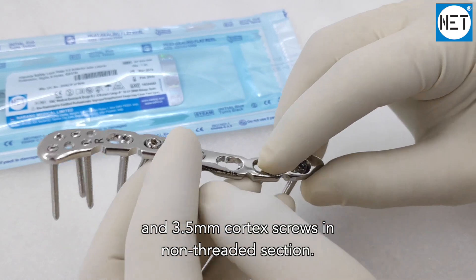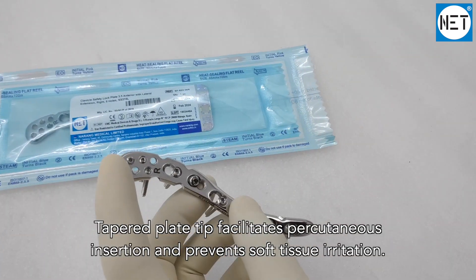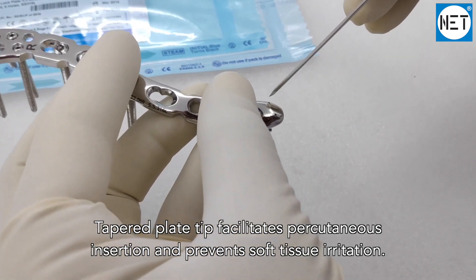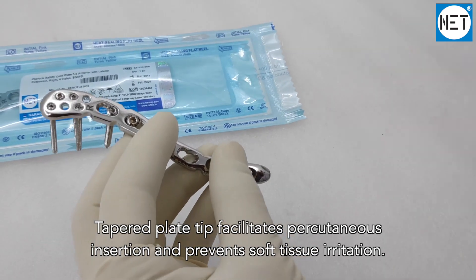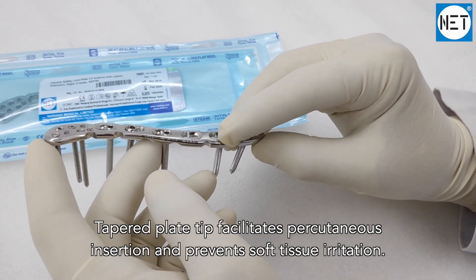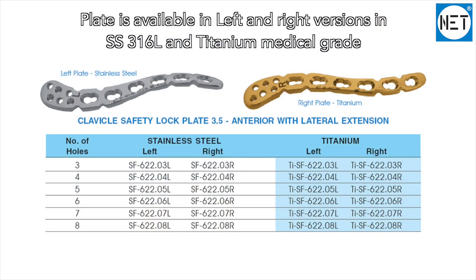The combination holes accept 3.5 millimeter cortex screws in the non-threaded section. The tapered plate tip facilitates percutaneous insertion and prevents soft tissue irritation. The plate is available in left and right versions, in stainless steel 316L and titanium medical grade.